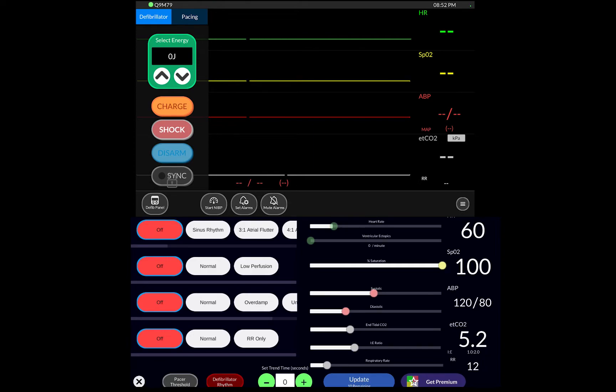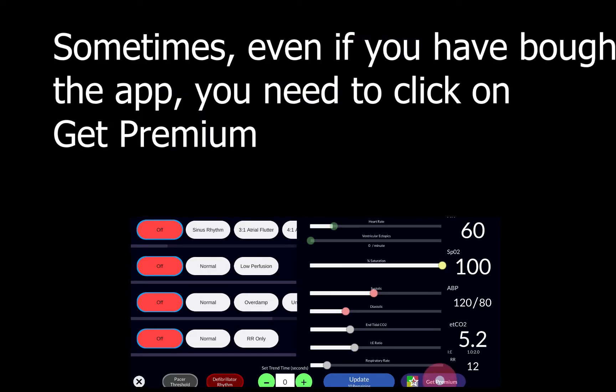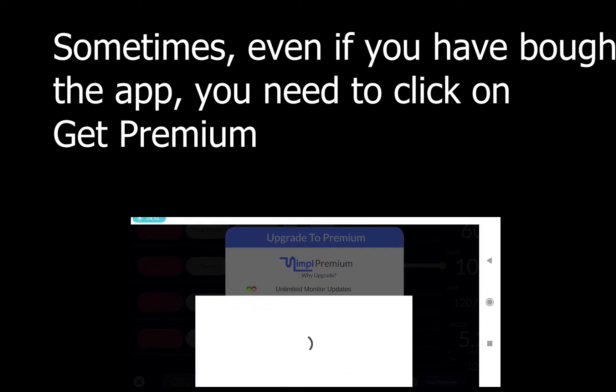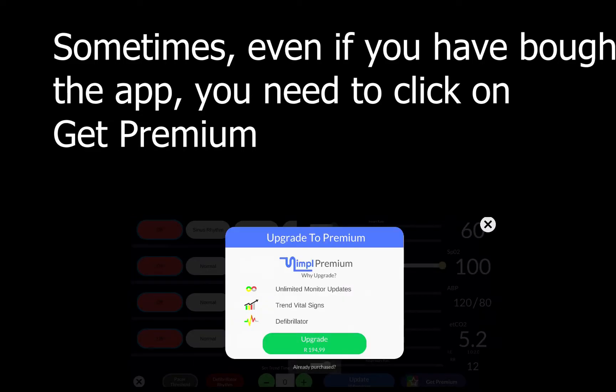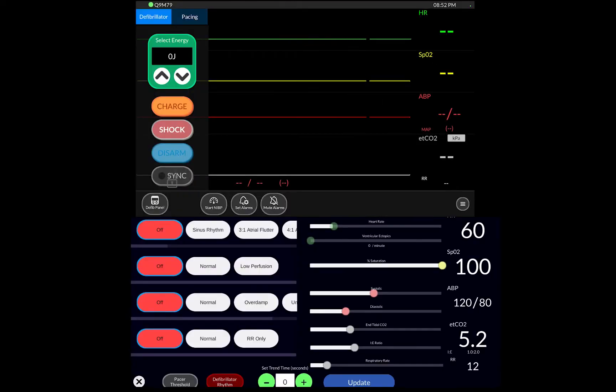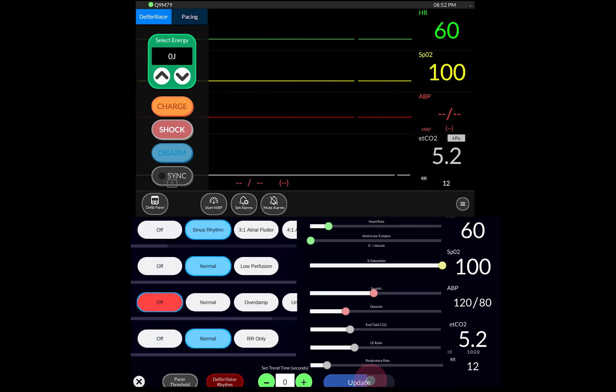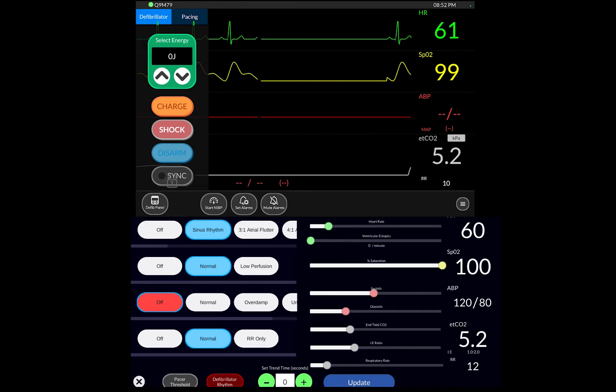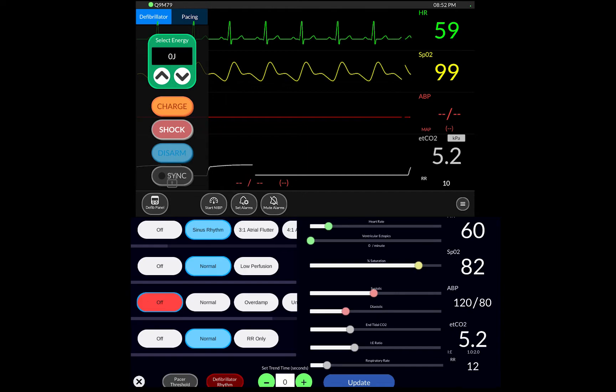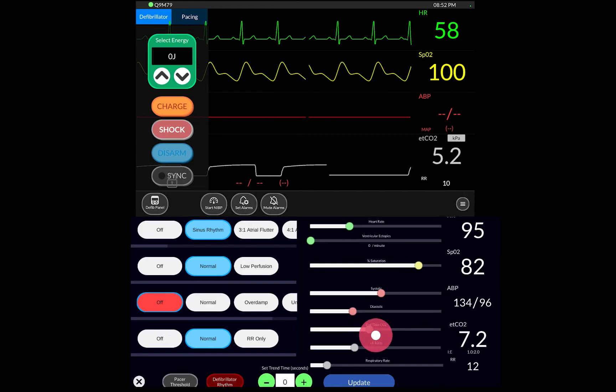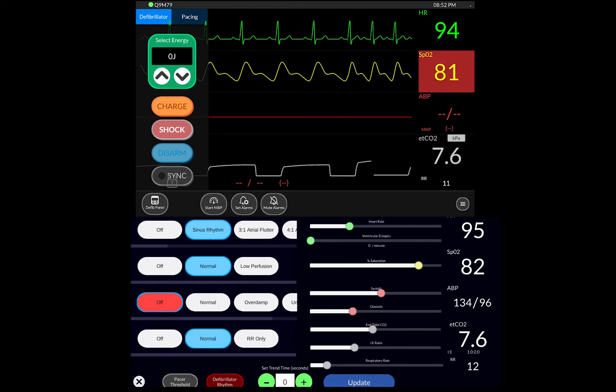What's important to understand here is that to show anything on the screen I have to update. You see there's an update button. If I change it to a sinus rhythm and I have normal saturation and I have a normal ETCO2 I can hit update and it shows on the monitor. If I want to change anything I can reduce saturation or I can increase heart rate or I can increase blood pressure and if I then hit update it then updates it on the monitor. So it's pretty straightforward.